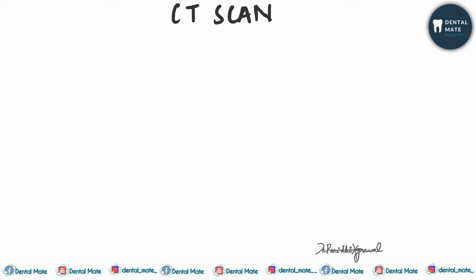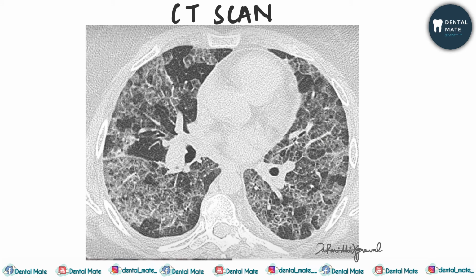Now, also what is seen in CT scan is a patchy diffuse ground glass opacity with thickened interlobular septa. See, thickened interlobular septa and also intralobular lines. Okay. See, this gives an appearance of disorganized paving stone. So, this type of appearance is known as the crazy paving pattern. What we need to remember is in CT scan, a crazy paving pattern is seen in patients with COVID-19 disease.